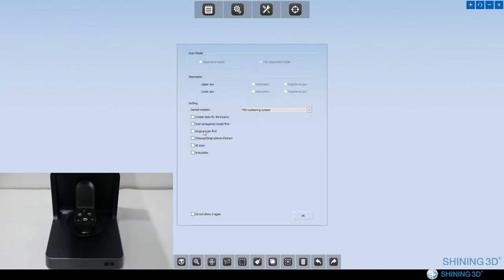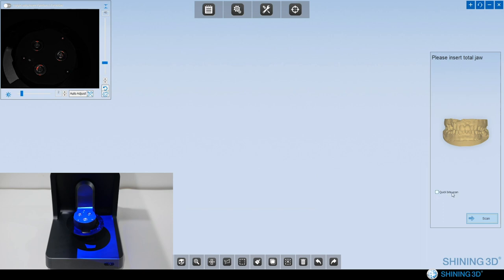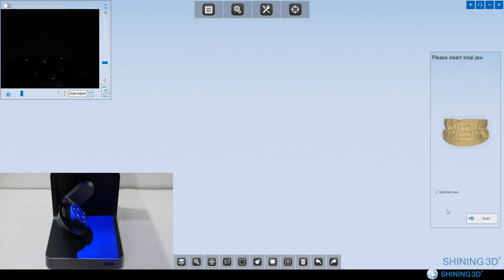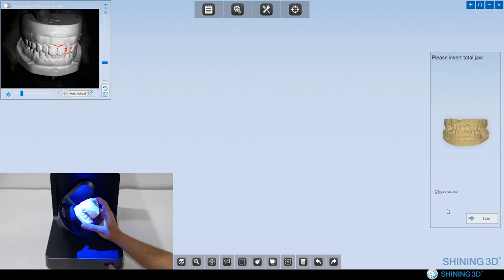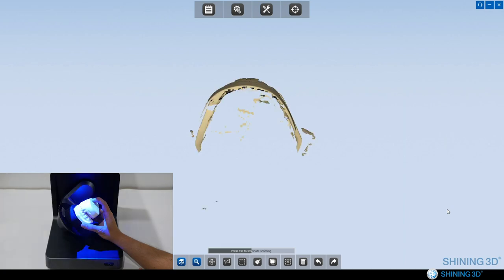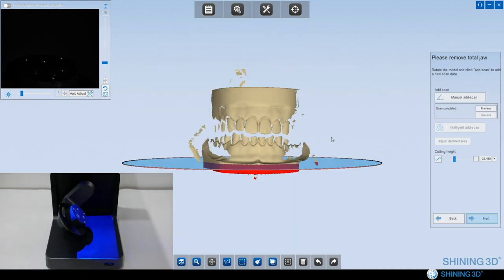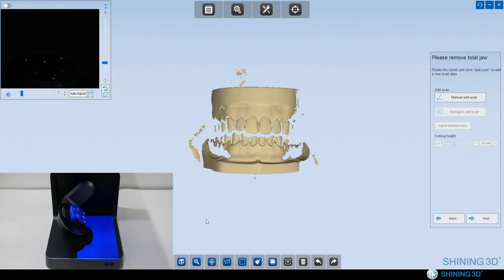Here we can activate the option gingiva scan first and extract gingiva automatically. The first step, total jaw. We can activate the option quick bite scan. Quick bite scan means we can directly place the upper jaw and lower jaw on the platform in a very quick way, no need to fix with pins, rubber band or anything else. Okay, finish the total jaw scan. We can edit the data and delete the extra data. Click next.